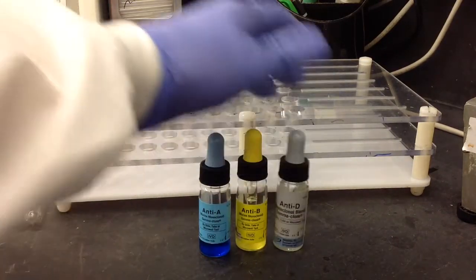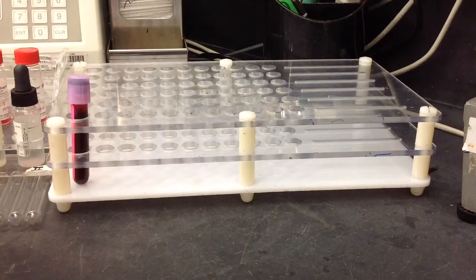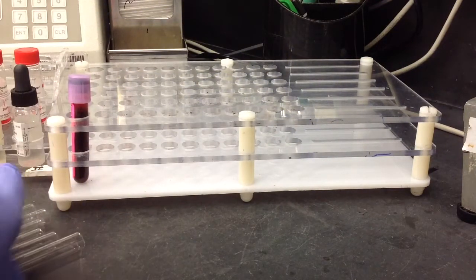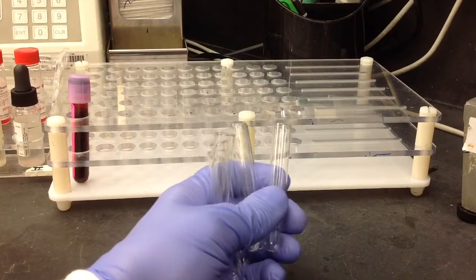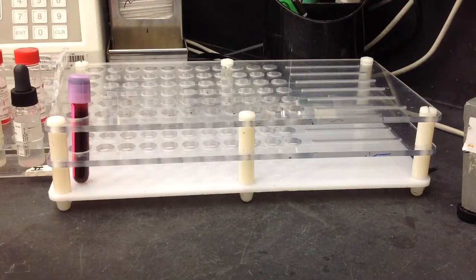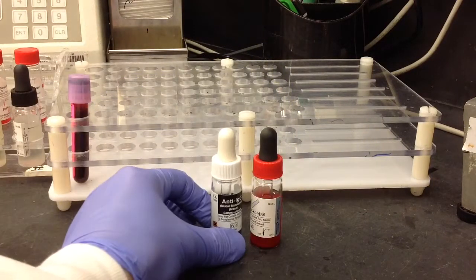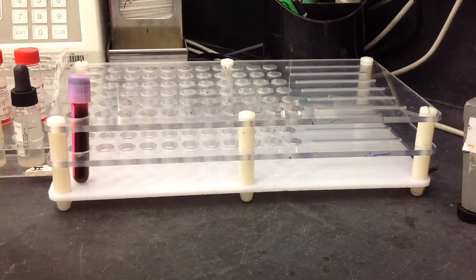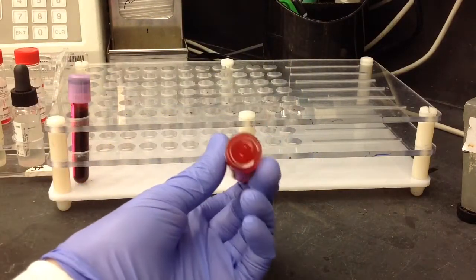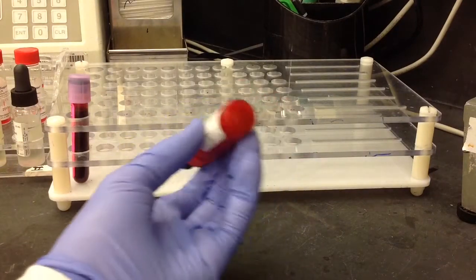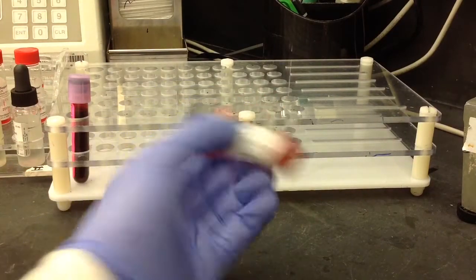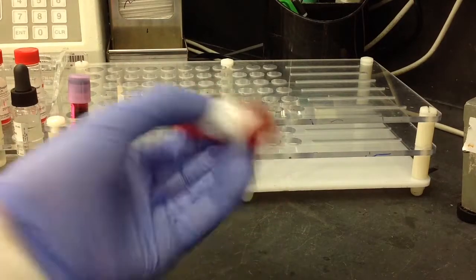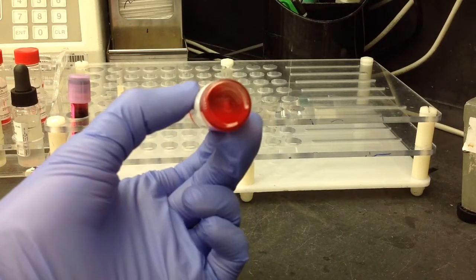And for that, you're going to need your AB and D antiserums, so that'll be for the ABORH. You're going to need some tubes. You're going to also need your AHG and your check cells for the DAT. And just make sure, if the check cells haven't been mixed recently, that you re-suspend all the cells that are stuck on the bottom of the vial there. See I got them off by mixing it.